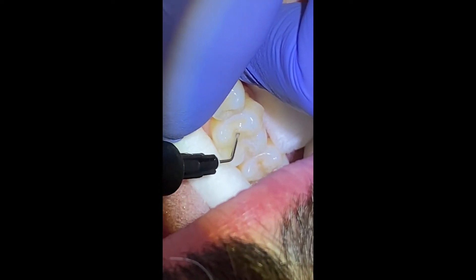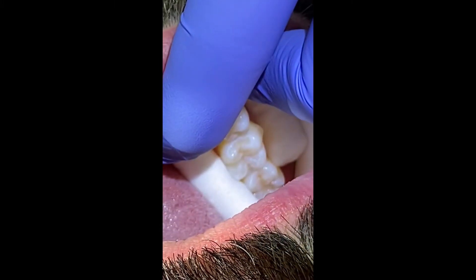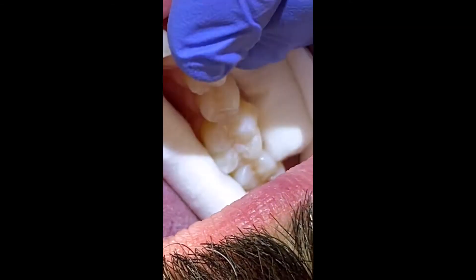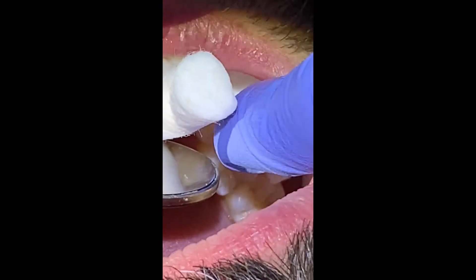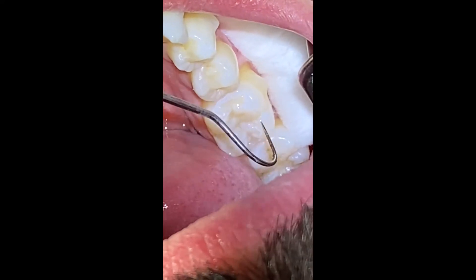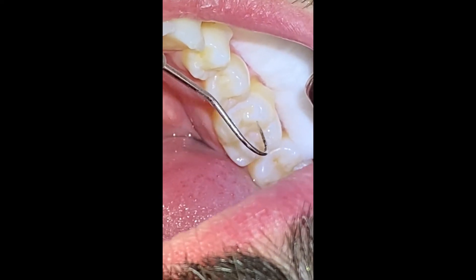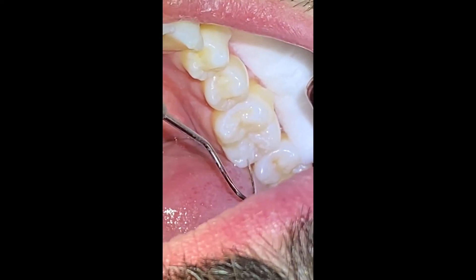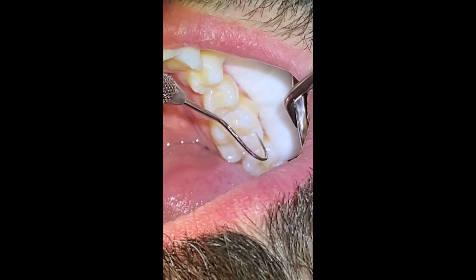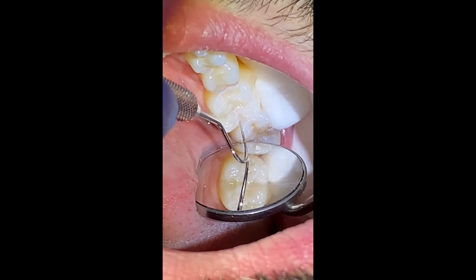Once we've got it covered, we are going to grab our curing light and cure for a minimum of 20 seconds. After 20 seconds, you're going to remove the curing light and use your mirror and explorer to test the sealant and make sure it has some retention. You're going to go along the edges of the tooth and try to lift off that sealant. You're looking for any voids, any bubbles, any missed areas of tooth structure. Use your mirror to evaluate all ends of the tooth.